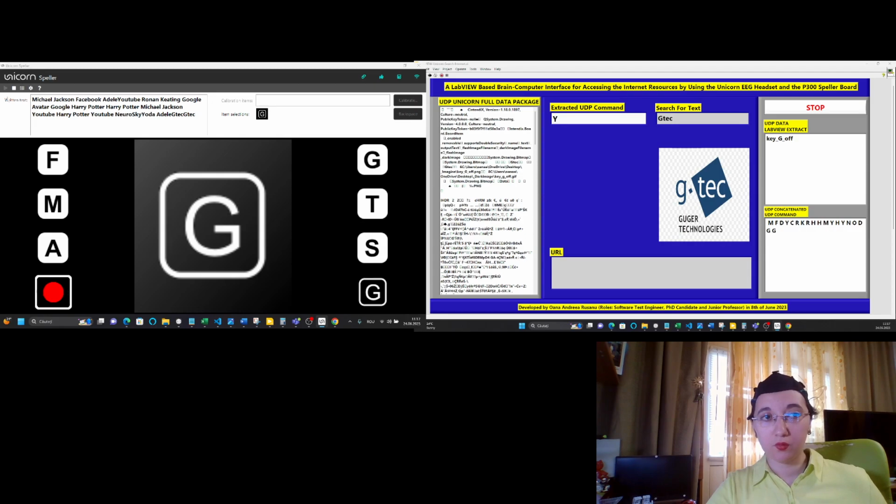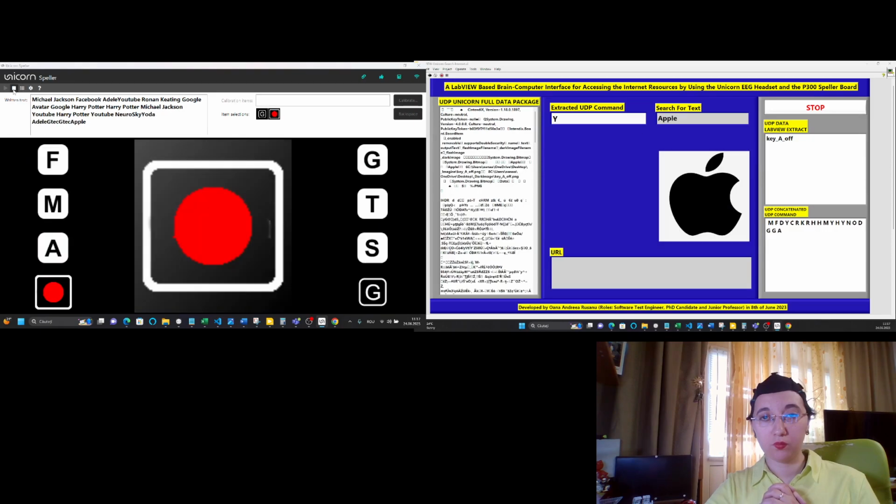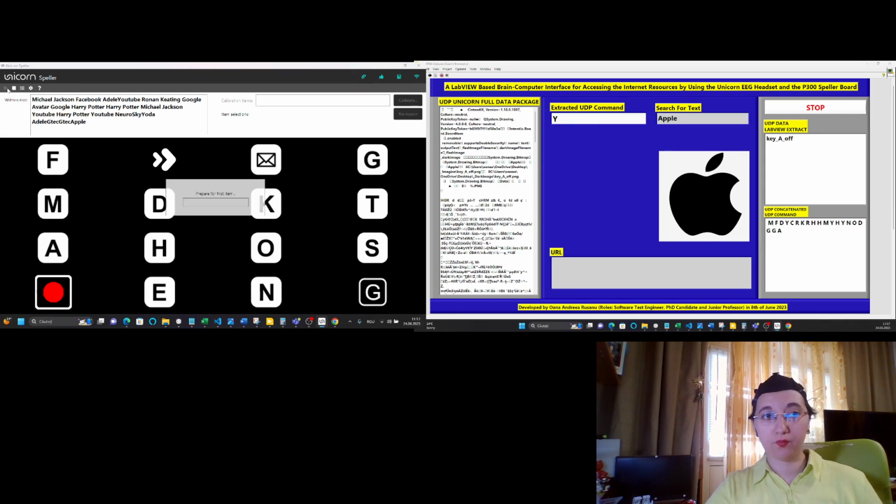Okay, I will stop the program. So let's repeat this. Try to select Yoda and then this one, Google.